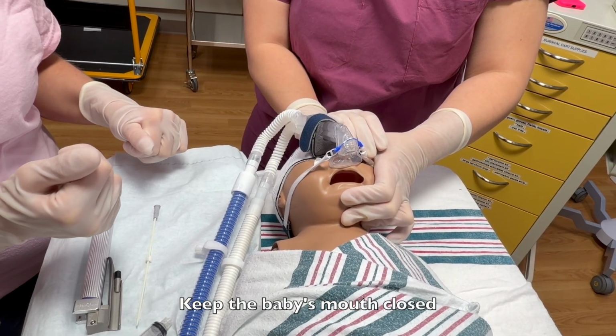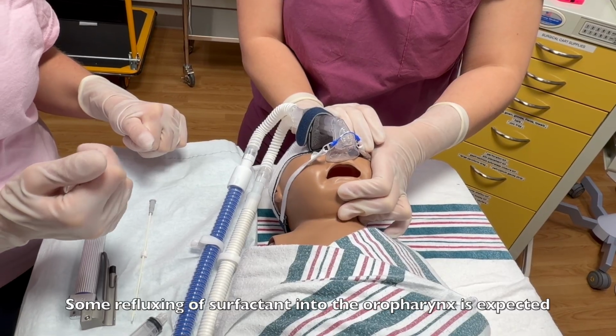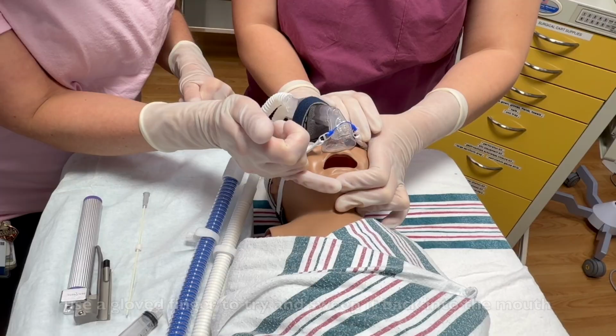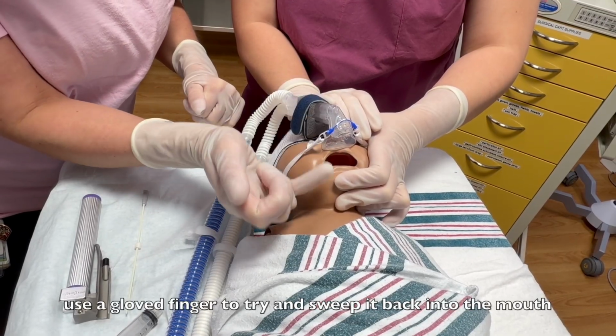Keep the baby's mouth closed. Some refluxing of surfactant into the oropharynx is expected. If surfactant refluxes out of the mouth, use a gloved finger to try and sweep it back into the mouth.